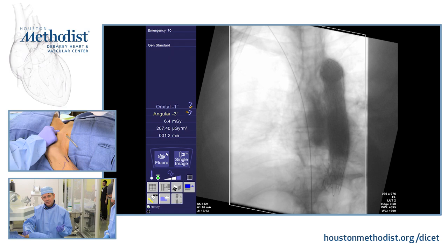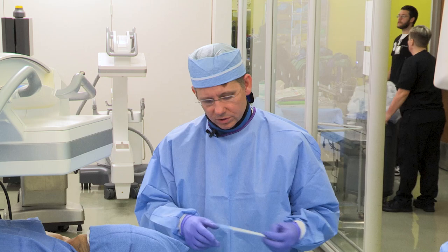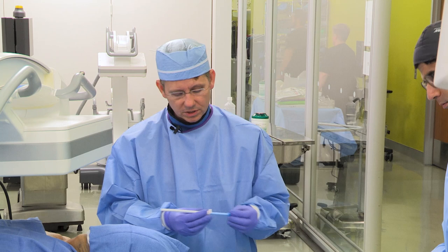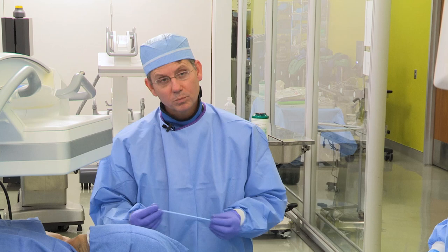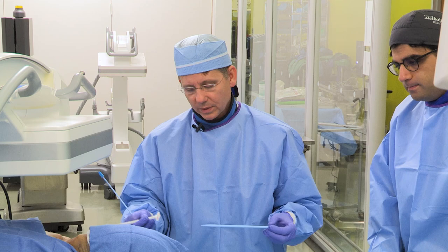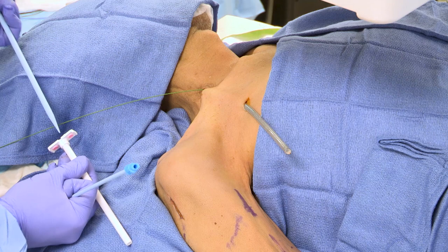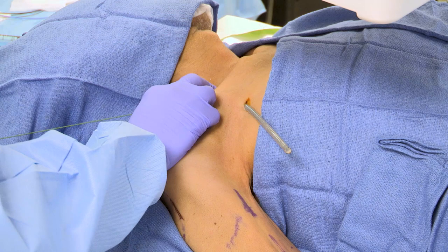At this point you have to decide how to get the outflow component to pass over the wire. There are two different methods. There's the on-label use where the instructions for use are published — that's using a large peel-away sheath with a series of dilators. That can certainly be done that way, but it's not our preferred method. We're concerned about potential for air embolus when we place the peel-away sheath, allowing air to escape into the catheter and down to the atrium. We've found that an easier and safer way is actually using the balloon dilation method first.